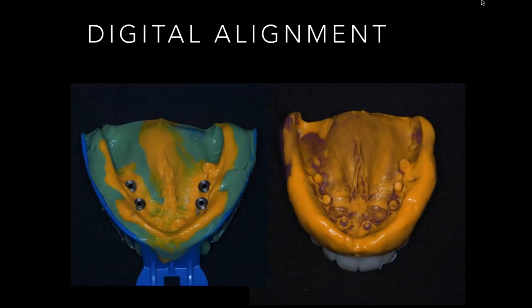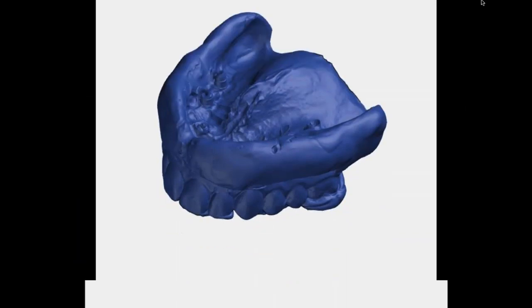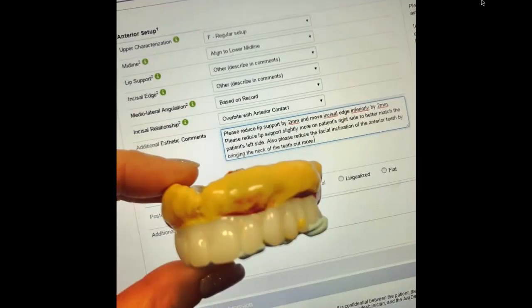But where that comes into play is that it is possible using digital technology to combine 2 different impressions of the same patient into a usable digital file. And what I mean is you take one type of record, a completely different type of record, you tell the computer which points align, and you create an alignment. Now what that does for you is you can now add additional information to your digital record. So for example, if you have an implant master cast, you can merge the tooth setup position from a completely different record. And now you have all of the information from that secondary record combined with the first. It allows you to get the information back to the virtual design.